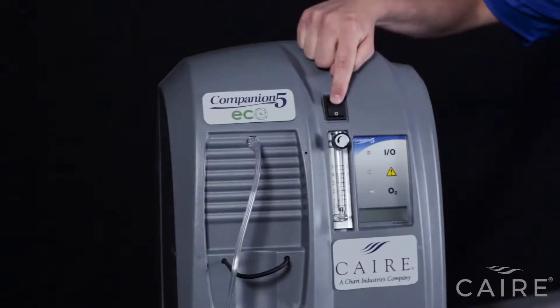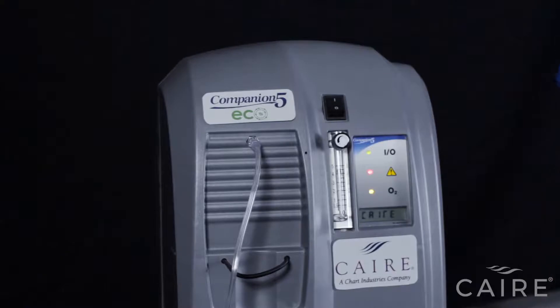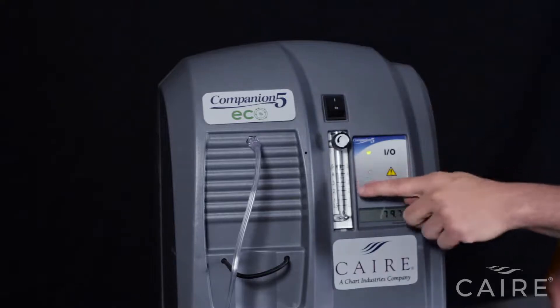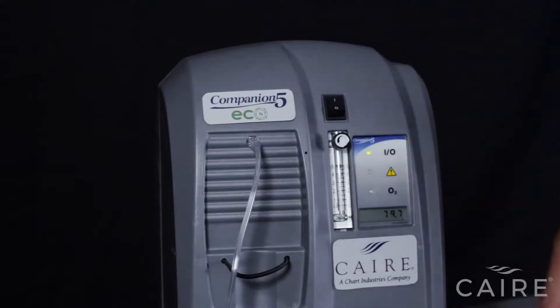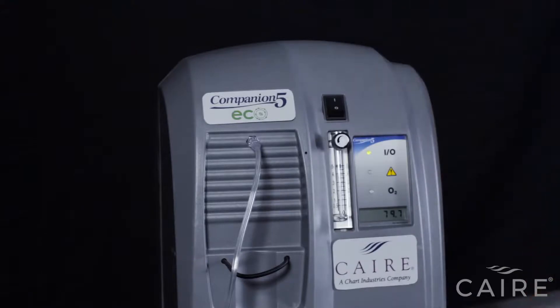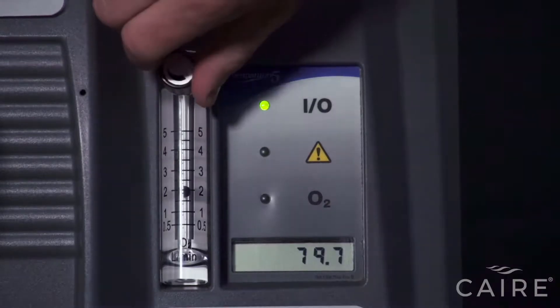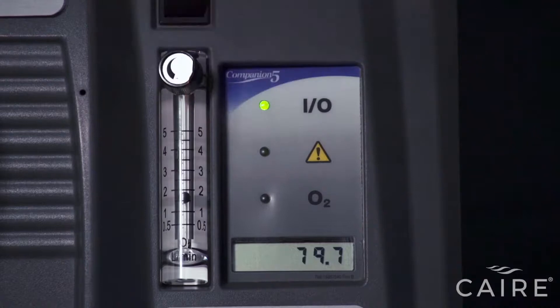To power on the unit, simply press the button upward. When you do this, all the lights will come on initially — that is normal — and then eventually just the green one will remain. To set your flow rate to the prescribed setting, line the black ball up exactly with the line of your setting. For example, if your flow rate prescribed by your doctor is two, you would turn it down until the ball is centered with the two. You leave it just like that where it's set, and next time you turn it back on, it will remember the flow rate you were at. And that's all there is to operating the Companion 5.